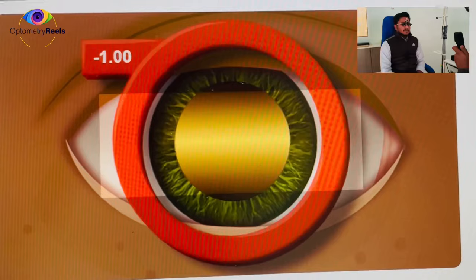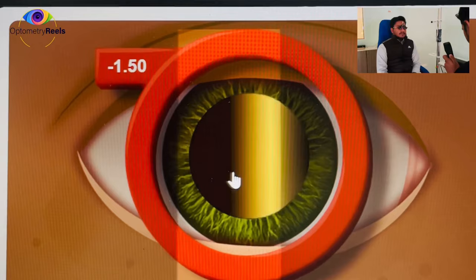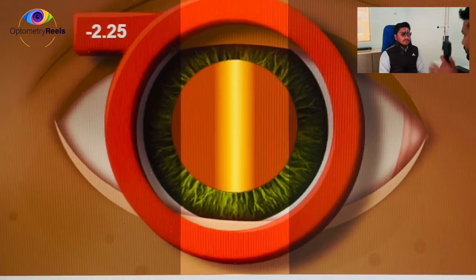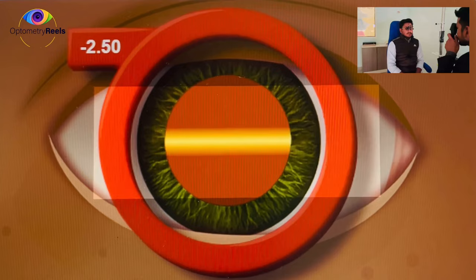I have introduced minus 0.5 and I'm increasing to see when it neutralizes. With minus 1, the movement is still against, but the thickness of the glow is getting sharper and thinner — a sign we are getting closer to the neutral point. With minus 2.5, it is still against, so I'll increase further.